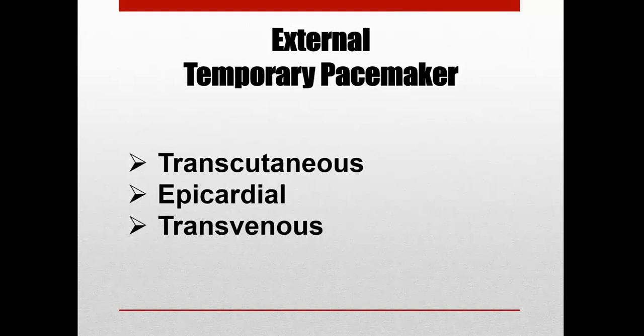These pads deliver an electrical impulse to the patient's thorax, which stimulates their myocardium. It's a rapid, non-invasive procedure that nurses most of the time perform in an emergency and when it's appropriate for certain patients during codes. It's used for short-term use, and it's typically pretty painful and can honestly cause burns to the patient because it's just constant electrical impulses sitting on their skin through a pad.